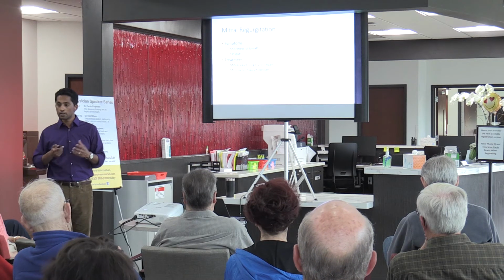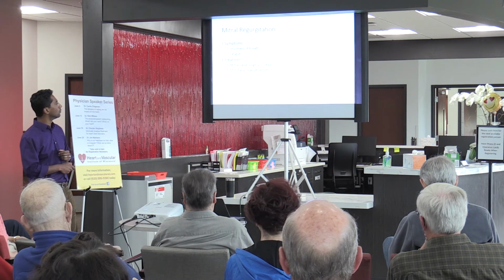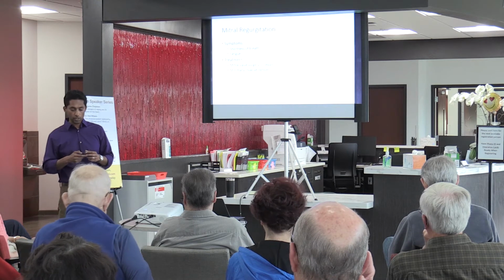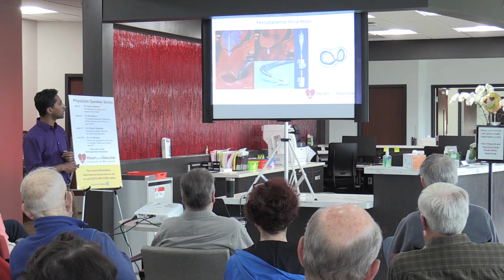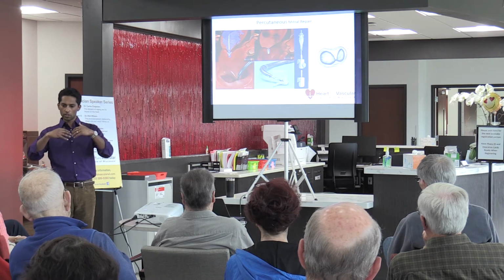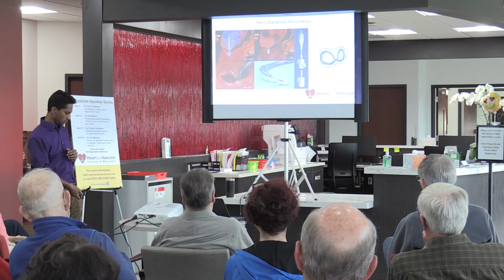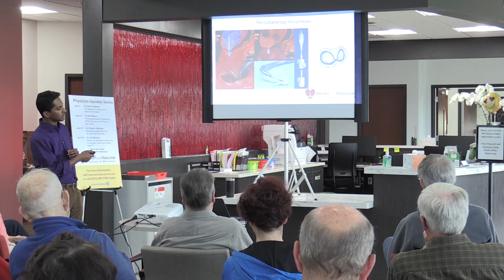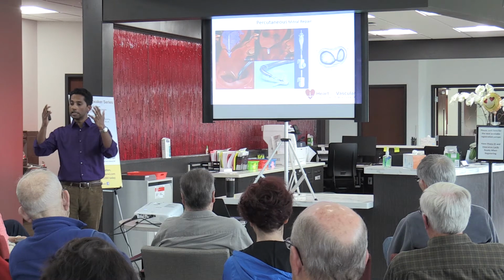Certainly, there are some cases where it's not possible to repair the valve, and so you may have to replace it entirely. And there are some more minimally invasive options. We talked about how not all valve problems have minimal options to treat them, but certainly mitral regurgitation is one that we do. There's a device that's called MitraClip. Basically, if you've got this valve that's leaking severely, it takes a clip and attaches it to the front and back leaflets, and you pinch them together. And the idea is that by doing that, you reduce overall how much leakiness there is, right?